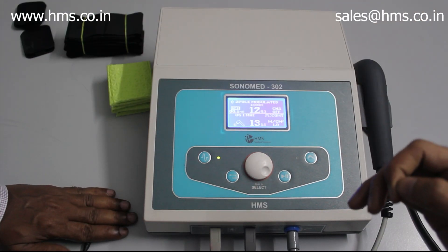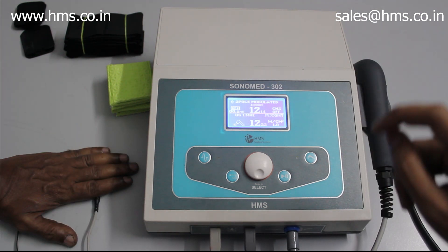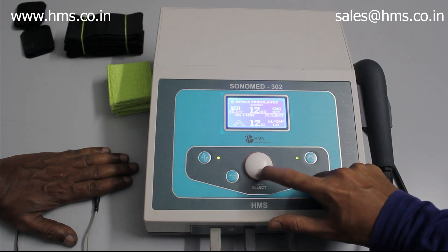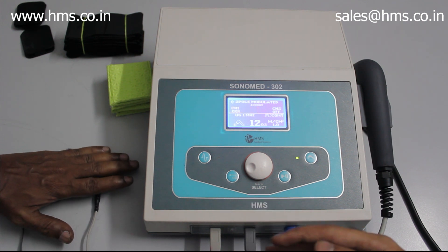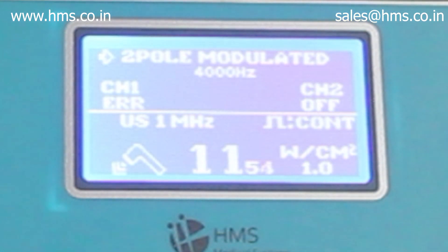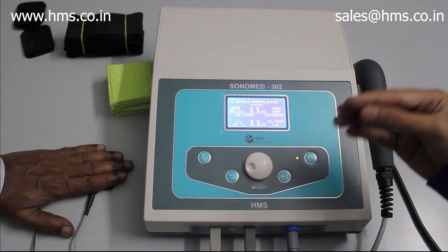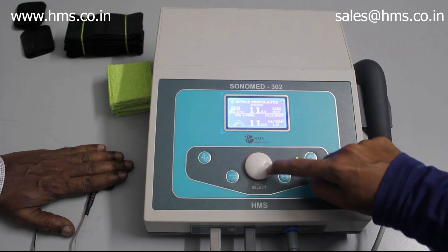Another key feature of the Sonomit 302 is the sensing feature, available for both electrotherapy and ultrasound. Here we see it working with electrotherapy — the electrodes are placed on a patient's hand. As the patient lifts their hand away from the electrodes, the treatment stops and the machine starts beeping with an error message. Only after placing the hands back onto the electrodes can you restart the treatment, and the intensity will start from zero, preventing the sudden shock seen in older models.